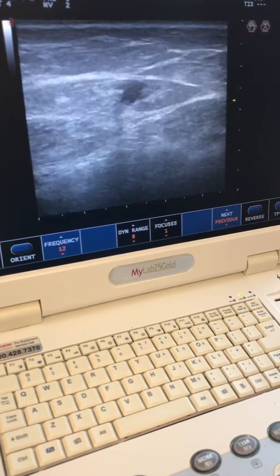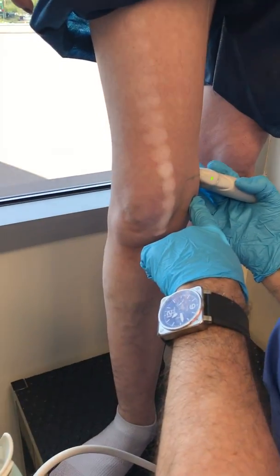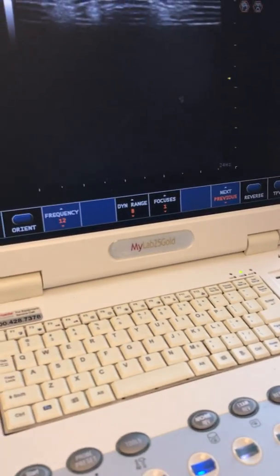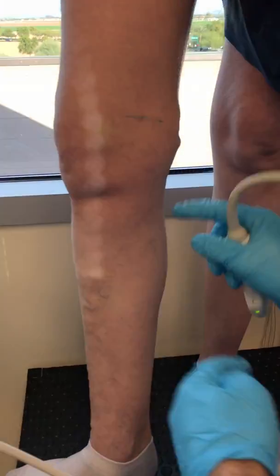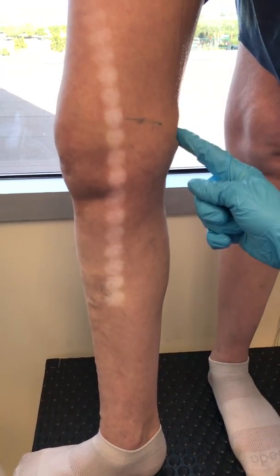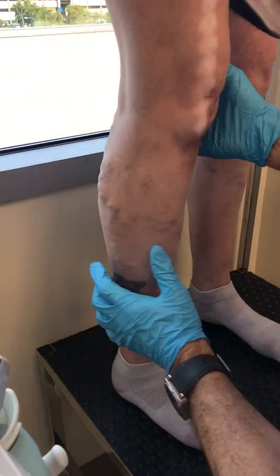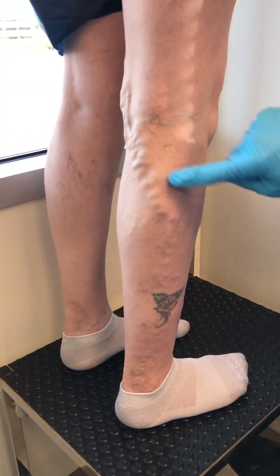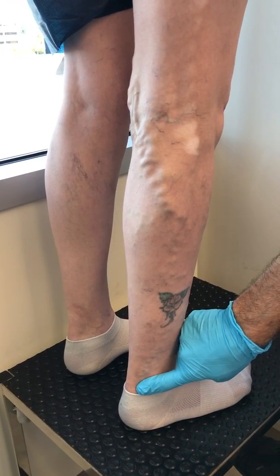We're going to mark her leg, we're going to go down here, we're going to access this vein, and we'll probably access it right about here. And then she's got all this reflux — all this reflux that comes down and then off this pipe here and wraps around the side of her leg. She's been really nice to let me show you all this, so you can see how significant this is — it comes all the way down through here and ends up on her ankle.